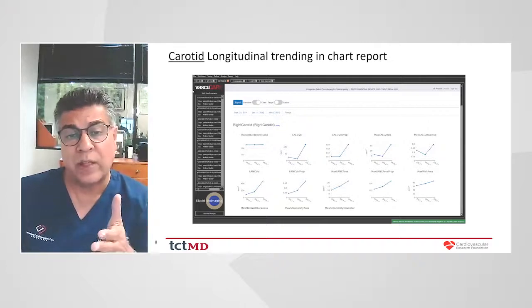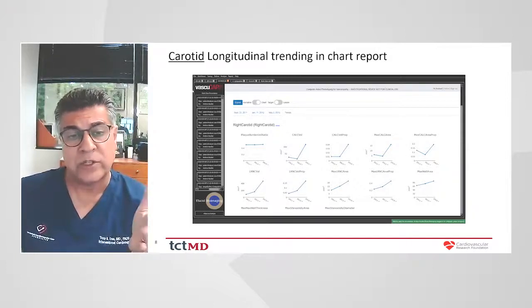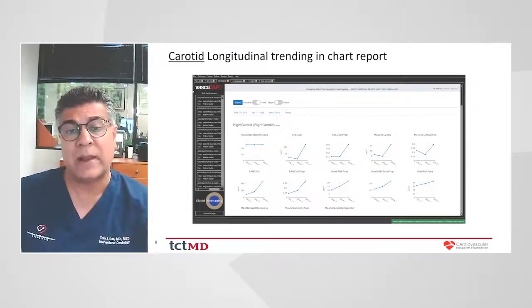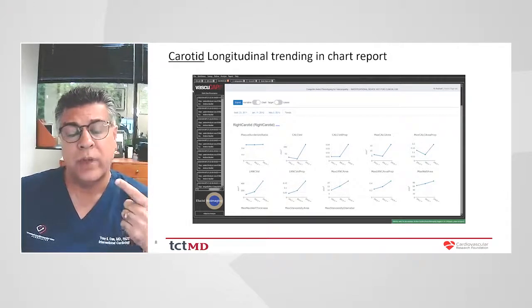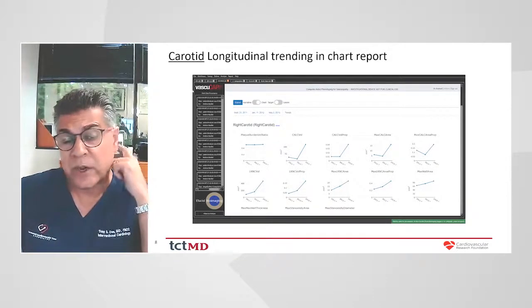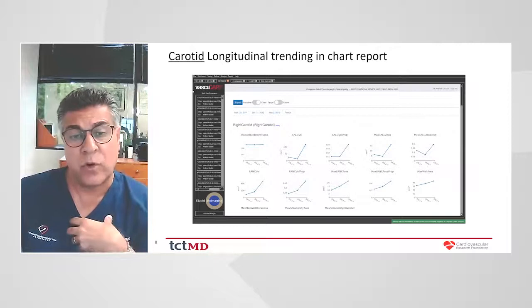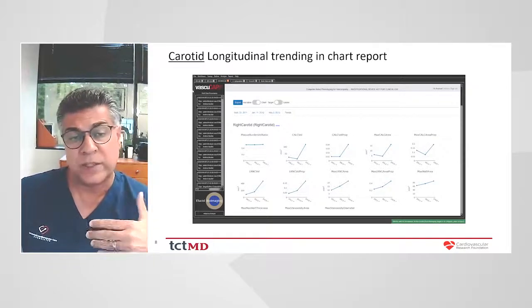And this is something you can follow over time, like we do for carotid disease now. We do carotid duplex and ultrasound, and when the patients have 50 to 70% lesions, we follow them every 6 months. If you added CT to that and you knew that calcification or the lipid-rich necrotic cores or other factors through time and evaluation with a large database of patients, you could then identify when you should intervene, because largely carotid disease is treated in asymptomatic patients to prevent stroke, as opposed to coronary interventions, which are frequently done when patients have symptoms. So this is a lot more predictive and useful in our clinical practices than potentially even the cardiac space would be.